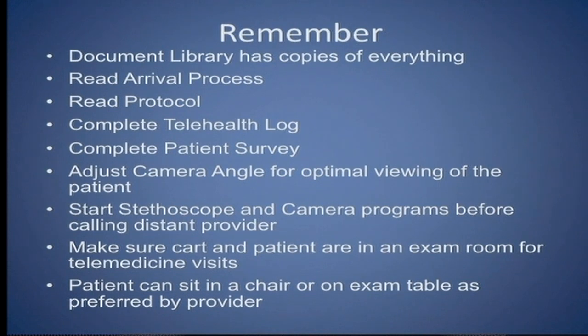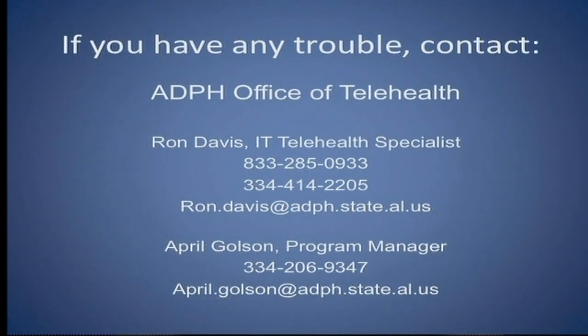Start the stethoscope and camera programs before calling the distant provider. Make sure the cart and the patient are in an exam room for telemedicine visits. Patients can sit in a chair or on the exam table as preferred by the provider. If you have any trouble, please contact the Alabama Department of Public Health Office of Telehealth, Ron Davis, the IT Telehealth Specialist, or April Golson, the Office of Telehealth Program Manager.